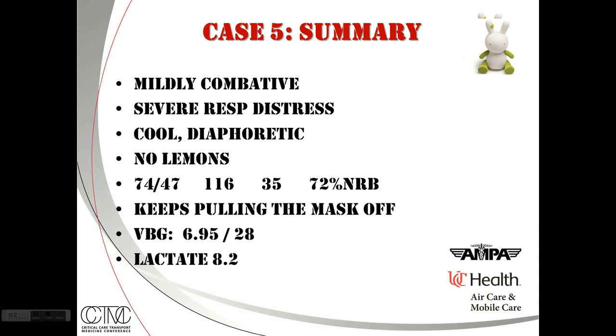And now that you've got his behavior controlled, minimizing the chance of displacement, I would go straight to the humeral site because of the 5 times greater flow rate there as opposed to tibial. And given that, with a pressure bag, we can very quickly get in a significant volume of crystalloid to help to maximize his preload.